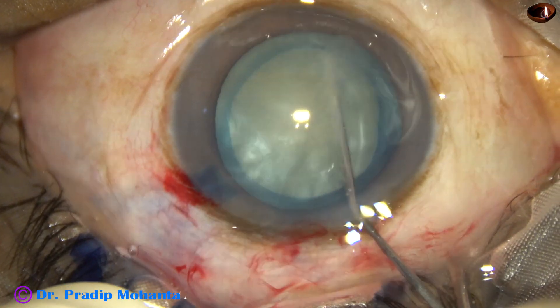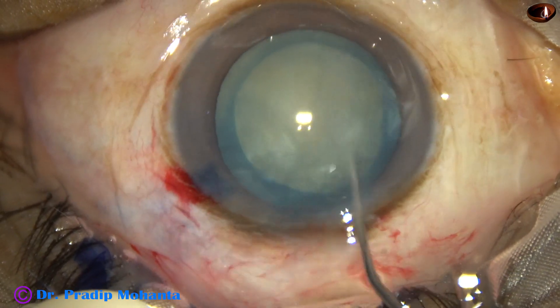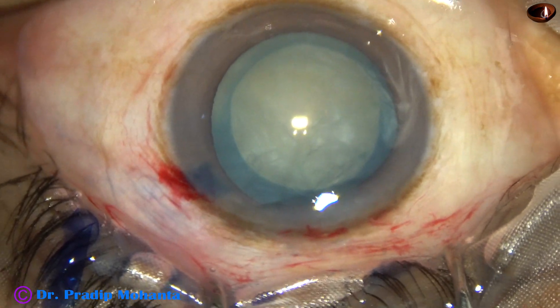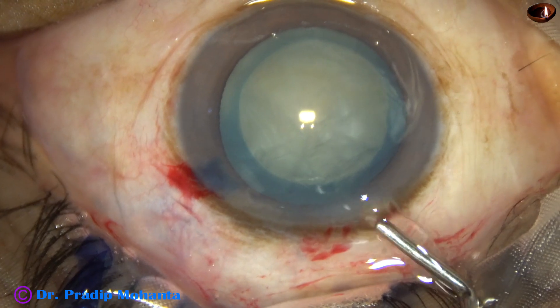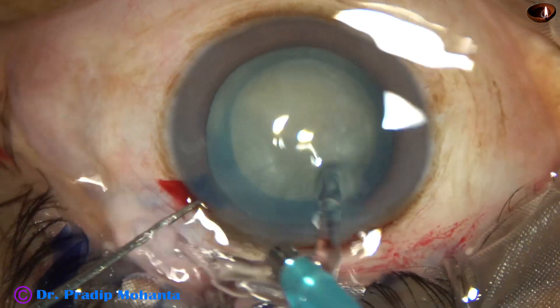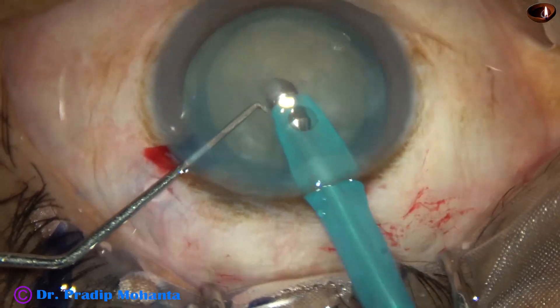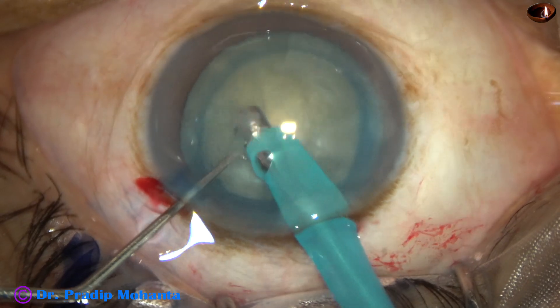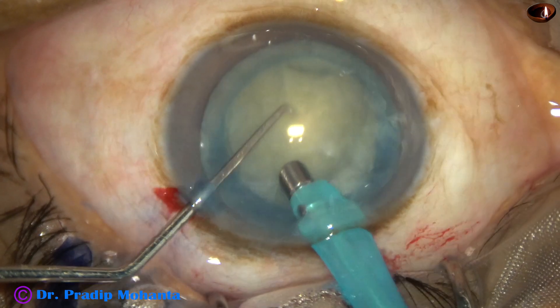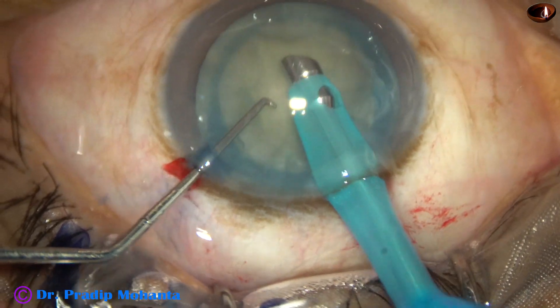If we can do rhexis of this type in most of the cases, do we really need femtolaser? Now the tip of the phaco needle is introduced. Some superficial cortical lens matter is removed.